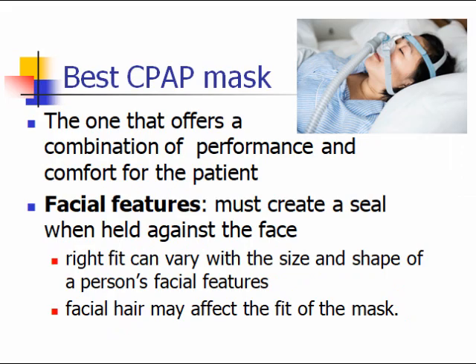You might ask, what is the best CPAP? There's a lot of different styles, different materials, different shapes. And really, when it gets down to it, the best CPAP is the one that offers a combination of performance and comfort for the patient. It is individual for each person.